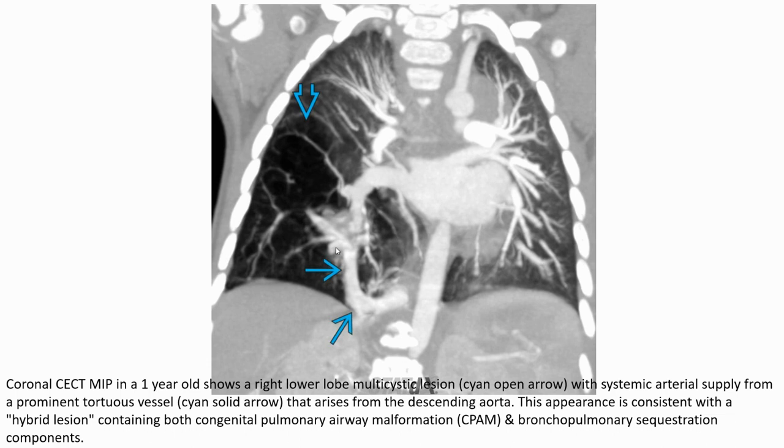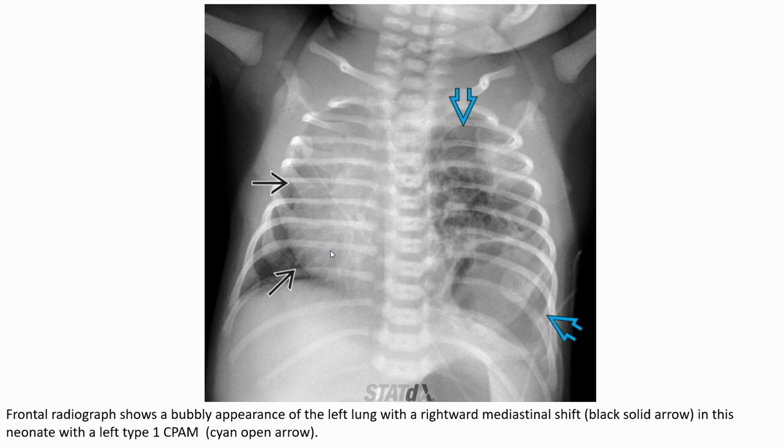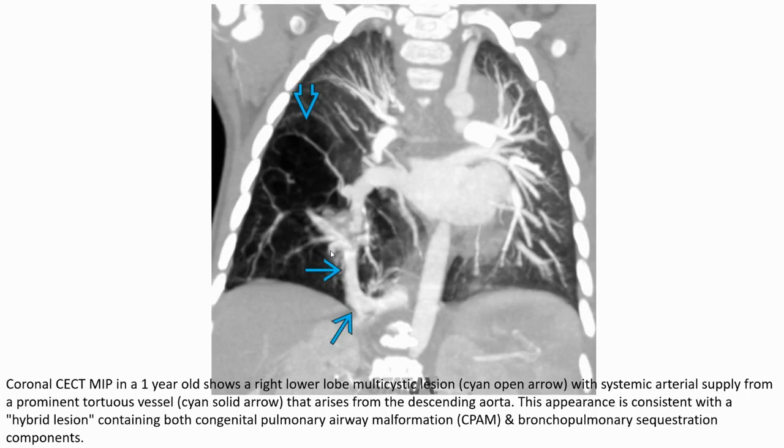This appearance is consistent with a hybrid lesion, containing both congenital pulmonary airway malformation and bronchopulmonary sequestration components.